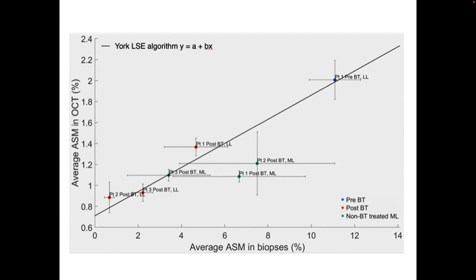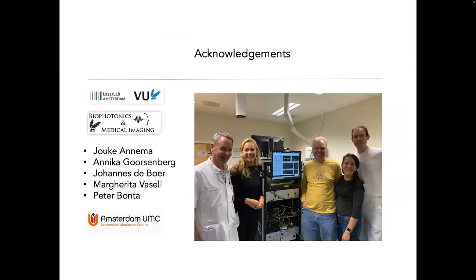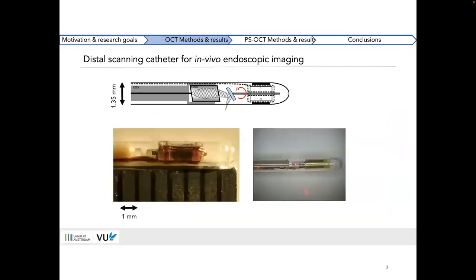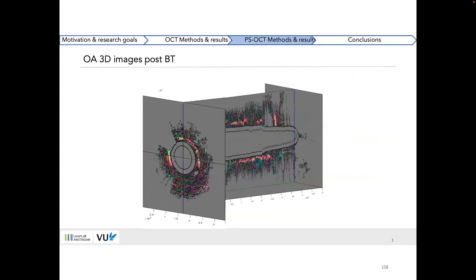So 2 to 4 out of 100 patients die because of just the diagnostic procedure. And we think we can do better. Where am I? I think I'm done. Oh yeah, these are, if they move, they're nice. No, they don't move. But this is like the 3D structures that you can generate when they rotate.